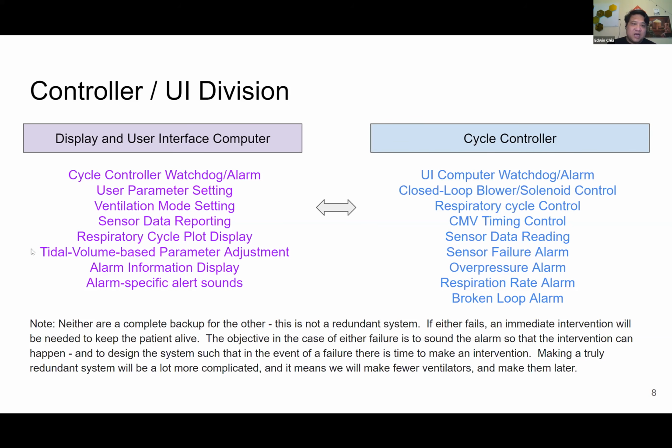The nice thing about tidal volume is that it's not something that you have to respond to right away. The machine has a minute or two to make a decision and to change this. If it doesn't immediately command the tidal volume on every cycle, the cycle controller will simply continue the breathing of the patient unobstructed.